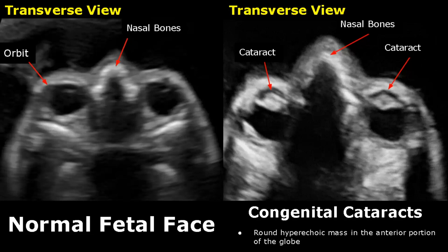Congenital cataracts can be diagnosed on ultrasound — we will see a round hyperechoic mass in the anterior portion of the globe. In the normal image, you can see the normal lens as a small dot in the anterior part of the globe, but cataracts appear as large hyperechoic masses.